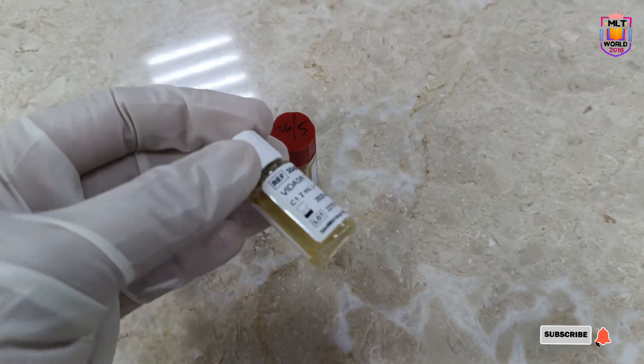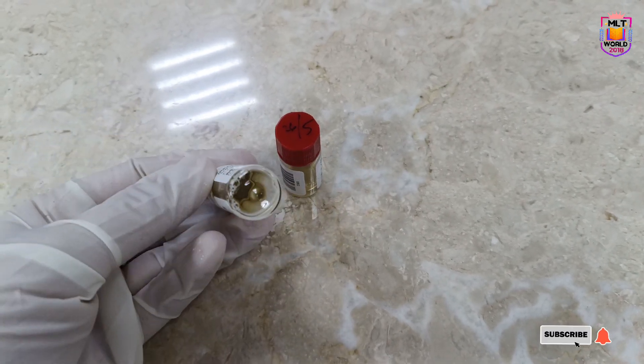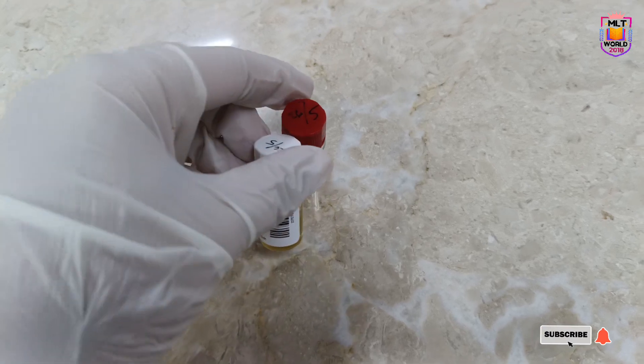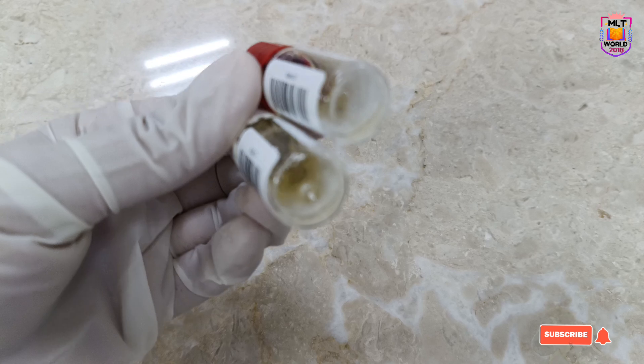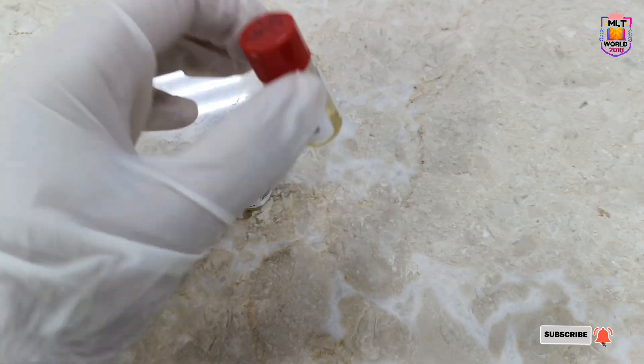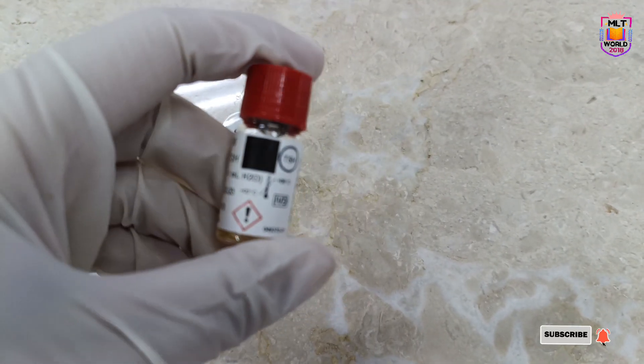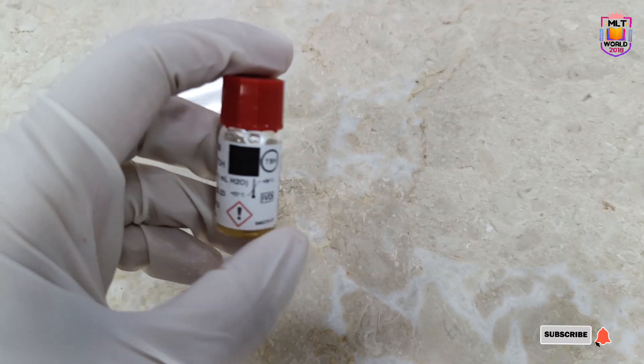An important thing: once you dilute your control or calibrator, after running calibration or control, keep your control and calibrator in the freezer at minus 20 degrees centigrade.